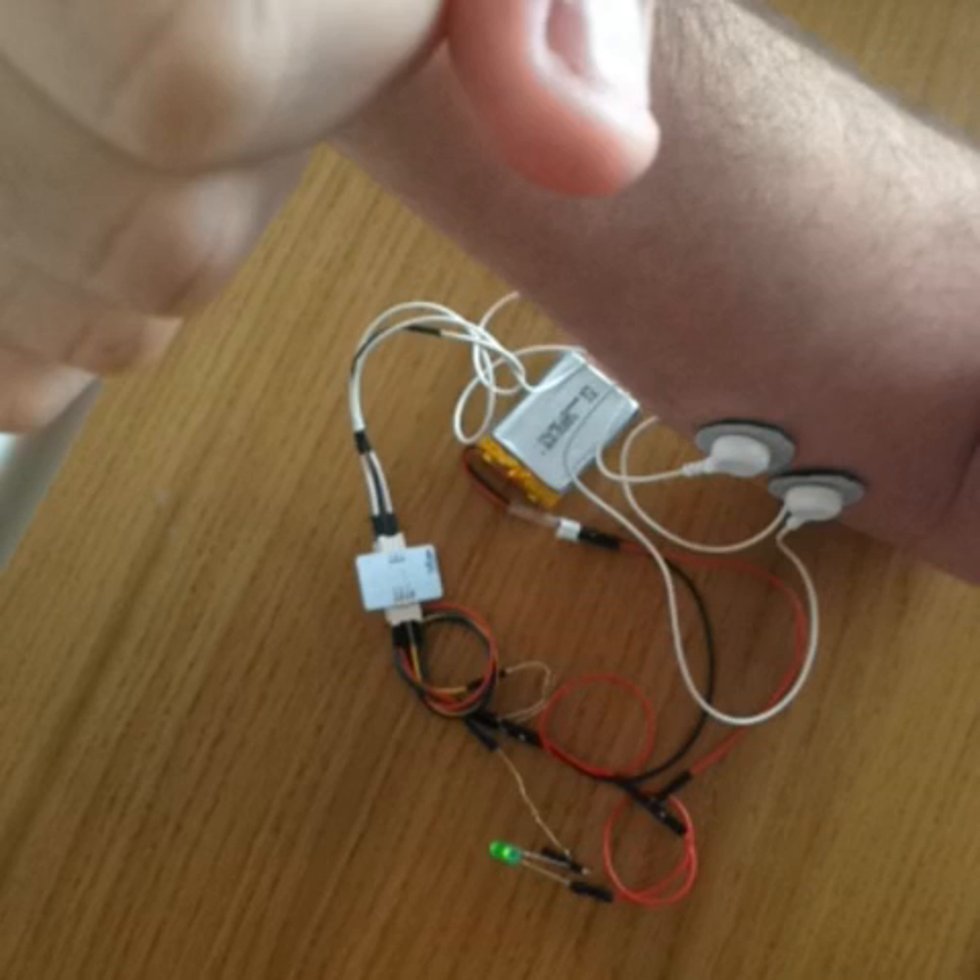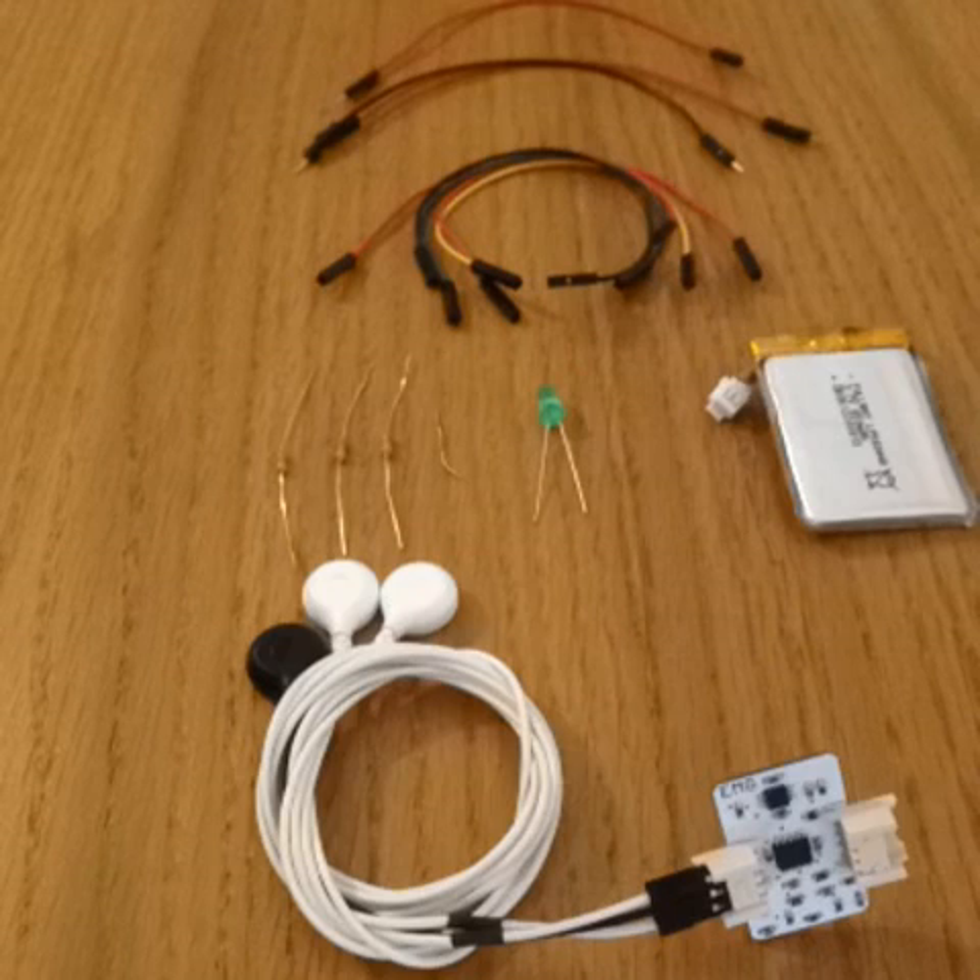A lot of people think that to work with Vitalino you need to know how to solder or how to code, but as we'll see today, it can be much simpler than that. This is a cool party trick that only requires a Vitalino EMG sensor, a battery, an LED, some resistors, and a few wires.